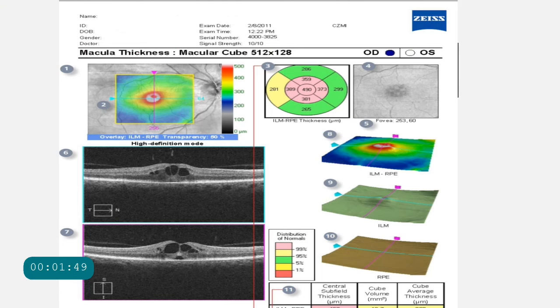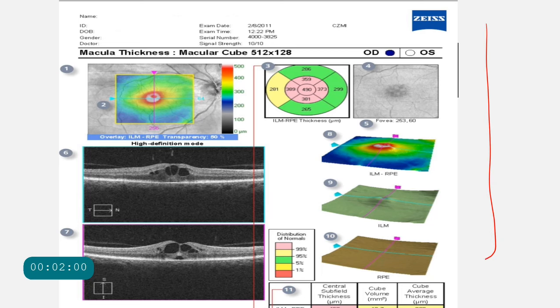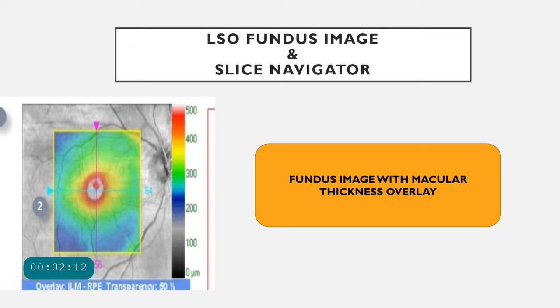Let us start with reading the macular thickness or the macular cube protocol of the Cirrus OCT. This is how the printout actually looks like, and we shall be breaking this down into various numbered sections — one, two, three, four, five, and so on till 11 — and we are going to study each of them one by one.